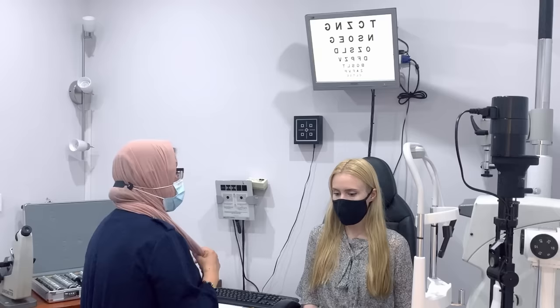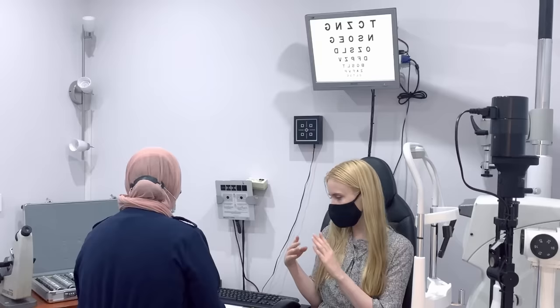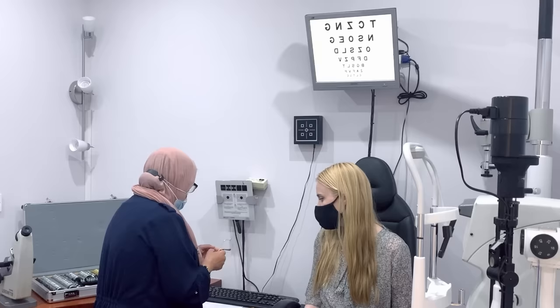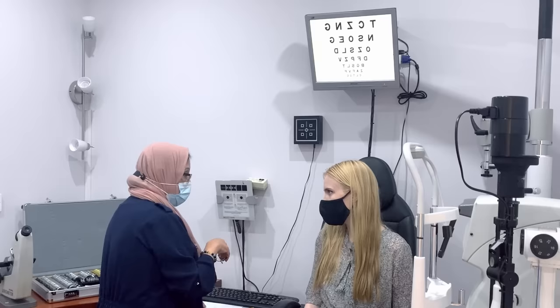When you said it had changed, does that... I think I was told I was minus one. So in your glasses, actually, you're minus 125 in both of them. That's what's in there now. Okay. So in your right eye now, you've gone down to minus one. Oh, okay. So you were 125 in here, and you've gone down to minus one. Does that mean I'm better? That's better in the right, okay.